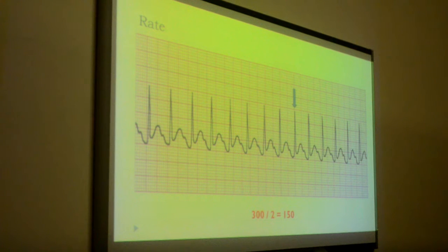It should be normal. It shouldn't be just a P wave, it should be a normal P wave. And we're going to discuss the P wave later on. Because there are times when it looks like a P wave. We know the axis of the heart, correct? What if the heartbeat originates ectopically from the left atrium? The P wave could be inverted. It looks like a P wave, but it's not normal. In this case, we don't call it sinus tachycardia, we call it ectopic atrial tachycardia. So yes, there should be a normal P wave before each QRS. That's how you call it sinus rhythm or not.